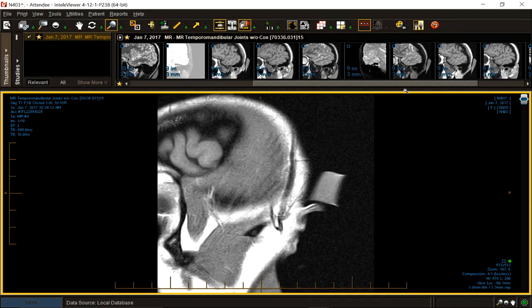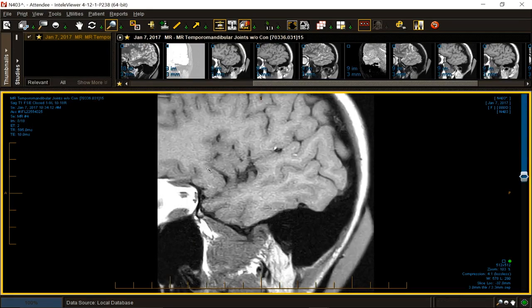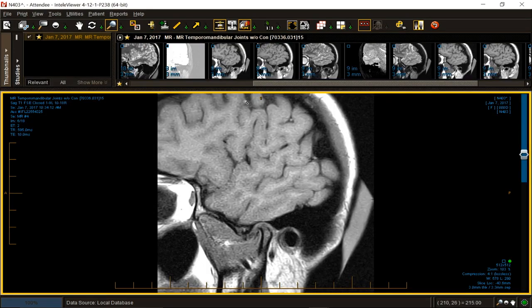Okay, the history is a 17-year-old. They're all women. 17 years old. She's a girl. Jaw locking all the time. Pain when talking. She got hit in the jaw with a soccer ball prior to this occurring in 2006. So quite a while ago. So when she was 7 years old, she was struck by a soccer ball, and this has evolved since that time. A very common history.